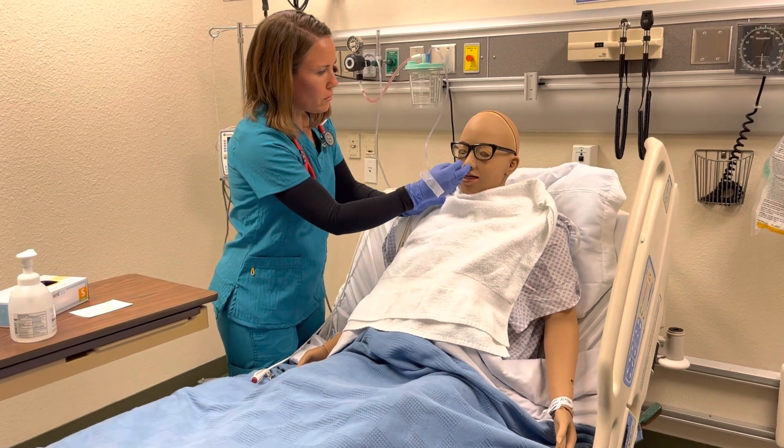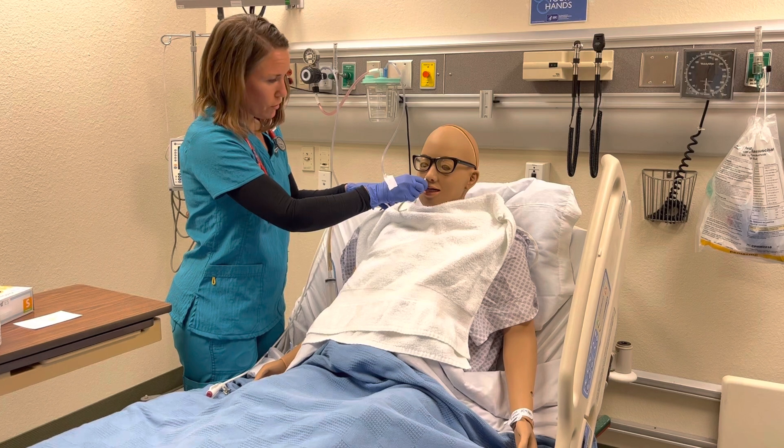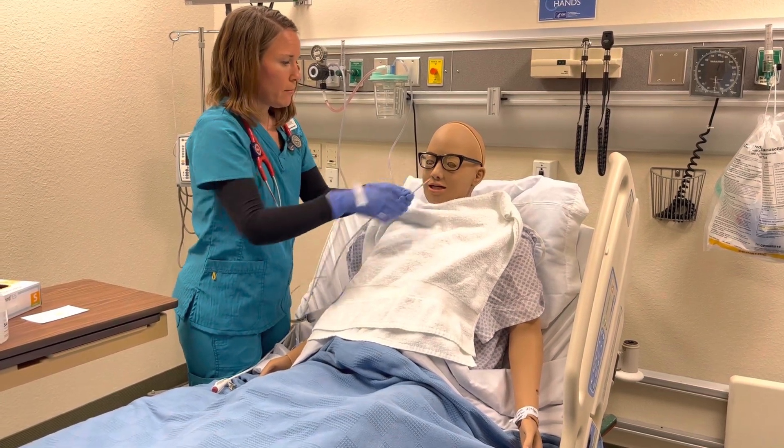I'm going to take this tape off your nose. So when you're ready, we're going to have you just hold your breath there. Hold that while we take this out quickly.